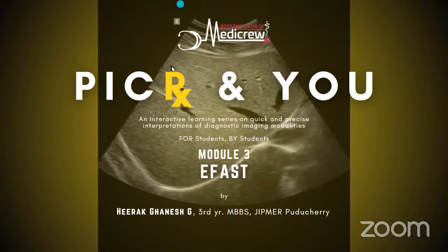This would be a class of about 1.5 to 2 hours, considering I'm taking out all the basics of ultrasounds, followed by eFAST. eFAST is a very specific part of ultrasonography, where you're essentially dealing with trauma. So to make it longer and much more beneficial for the students, I'm covering all the ultrasonography basics.